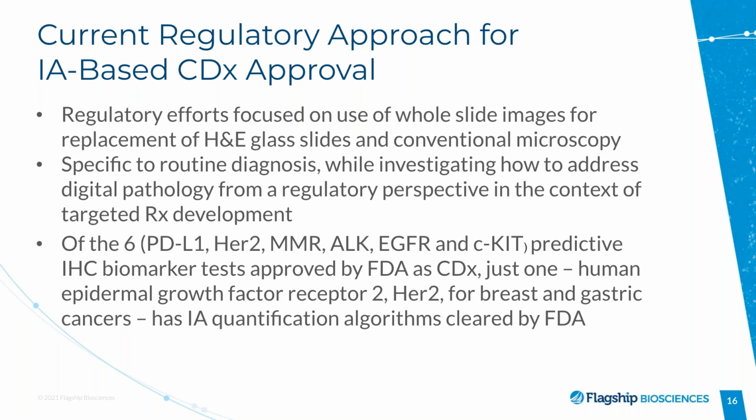Yeah. So, to conclude a little bit what we were talking about before, in terms of creating the regulatory and analytical framework for this assay, one has to keep in mind that there is a lot that goes into each phase. Starting from receiving the images and making sure that the images have been scanned with a scanner that is compatible with the digital solution one has created. Then going on to the development of the algorithm and the verification of the algorithm vis-a-vis the manual pathologist. There is a lot that one has to do.